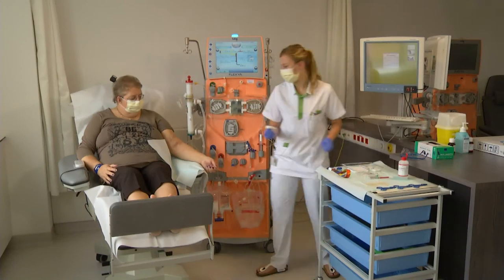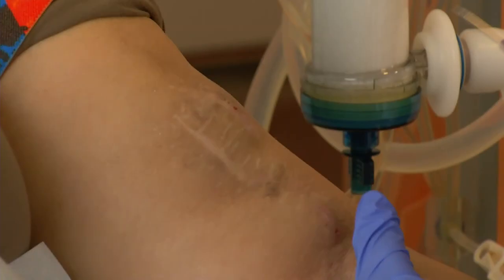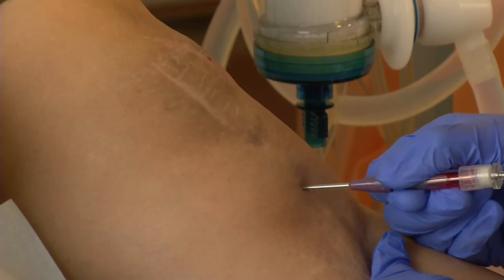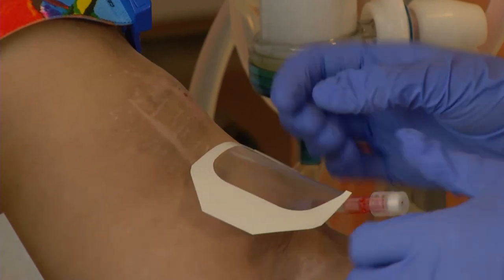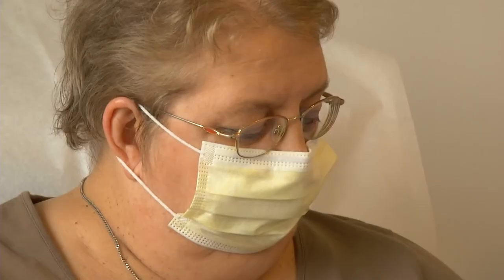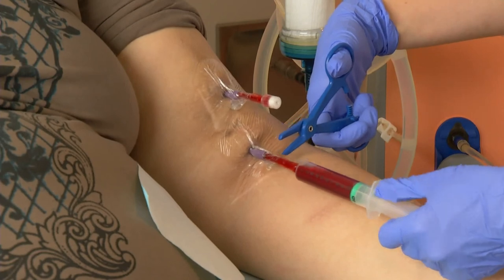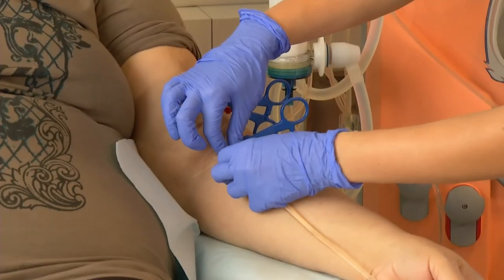The vascular access is an essential part. The SupraHFR technique requires a double needle system. The connection of the patient is done in an aseptic way. We puncture the arteriovenous fistula with catheter needles and fix them with a transparent dressing. After checking the patency of the access, we disconnect the red and blue connectors from the machine and connect these blood lines to the catheter needles of the patient.